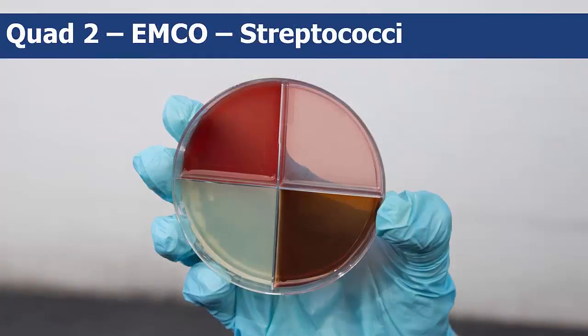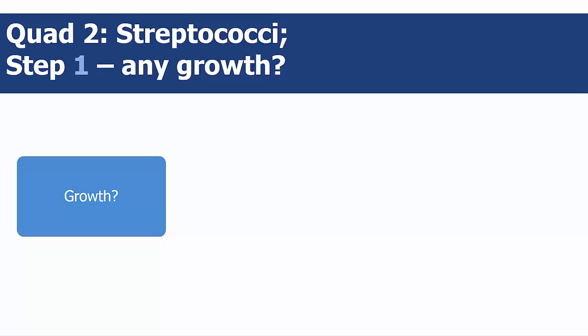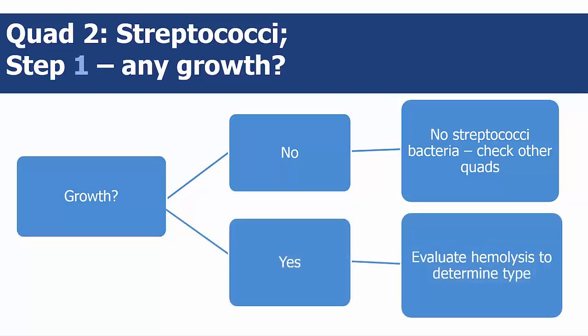The second quadrant will determine whether or not the bacteria are streptococci. Again, step 1 is to determine if there is any bacterial growth. If there is no bacterial growth, you do not have any streptococci bacteria and you can proceed to check the other quads. If there is growth, proceed to step 2, which is to determine whether the colonies are esculin-positive or esculin-negative.